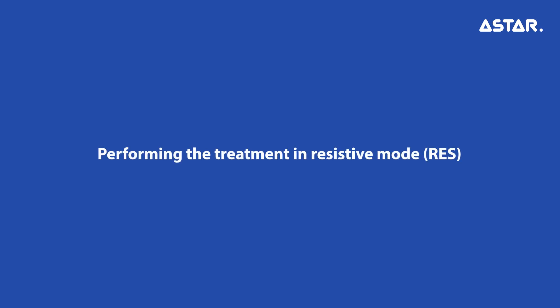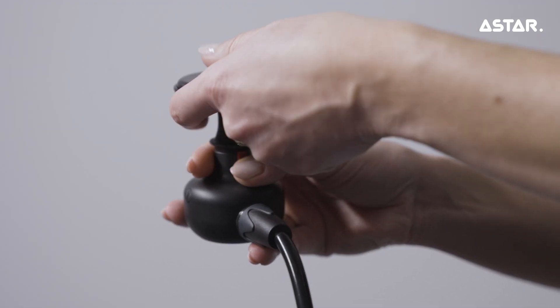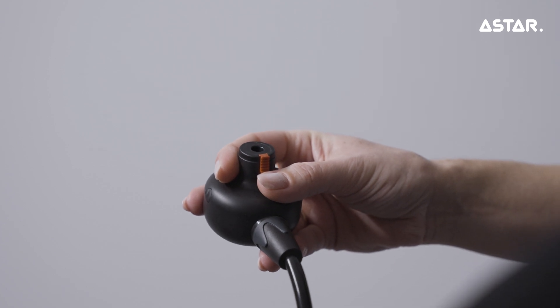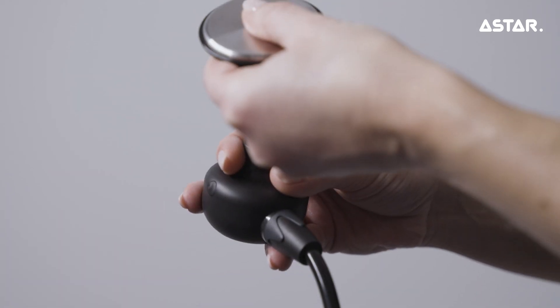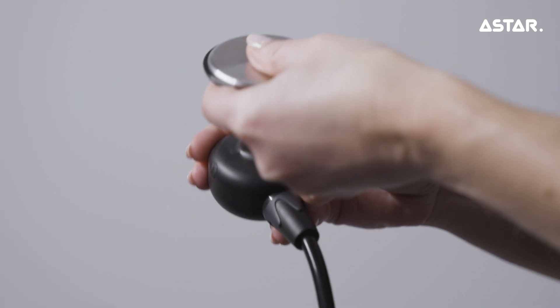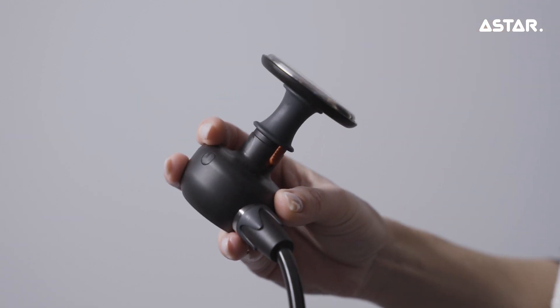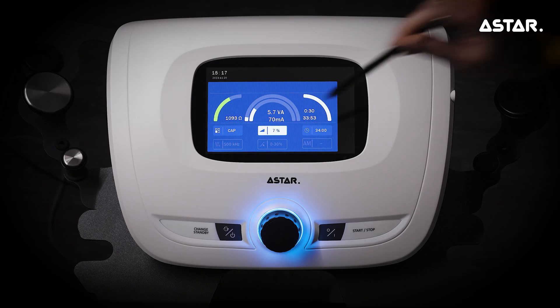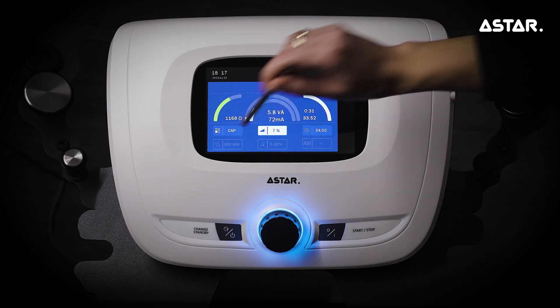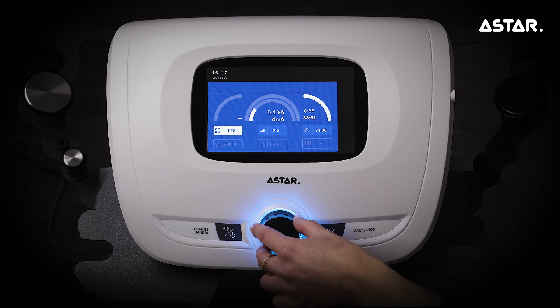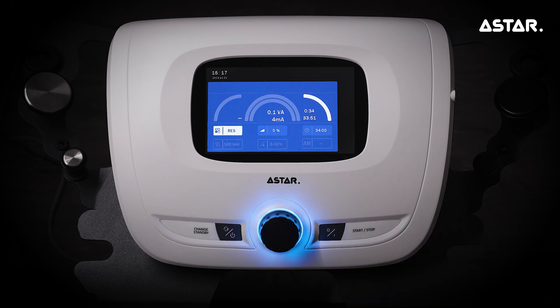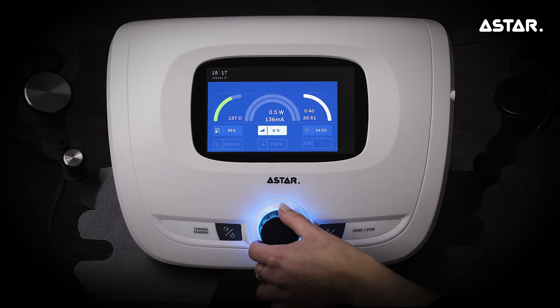Performing the treatment in resistive mode (RES): to disconnect the active electrode, push the red locking button downwards and remove the electrode. Mount the resistive active electrode in the applicator. Select the RES (Resistive) operating mode. Place the electrode on the treatment site and set the power value using the knob.